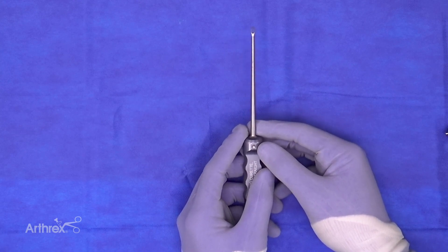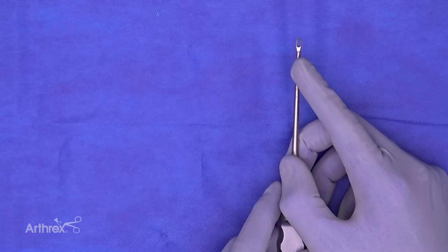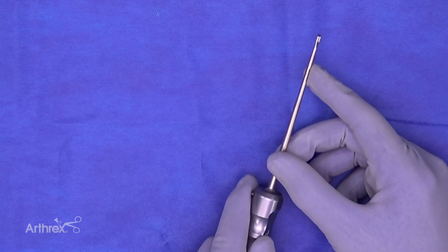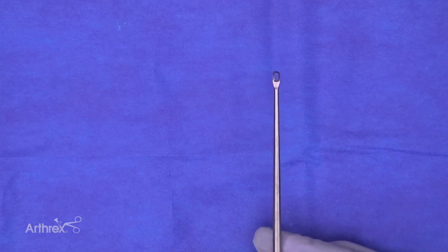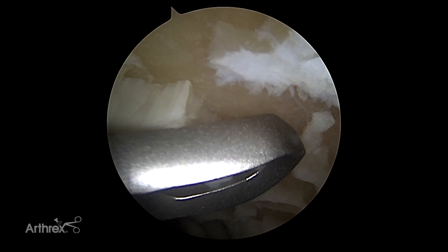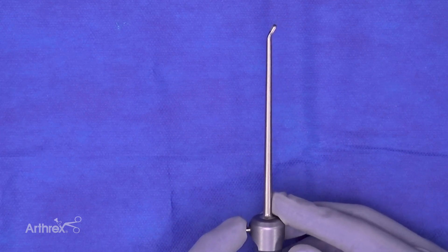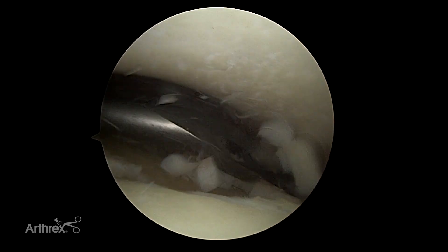We have three versions of ring curettes. One improvement from the original arthroscopy set is that we beefed up the neck of these instruments and went to a more rigid stainless steel — they won't break or dull as quickly. We have a straight curette cutting on both sides, a curette with a slight up-curve on the tip, and finally a down-curve curette that works well in the posterior aspect of the talus.